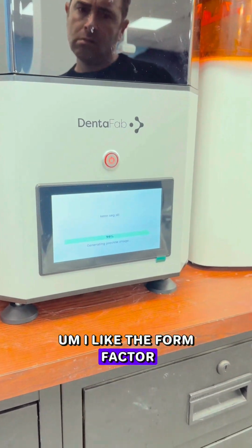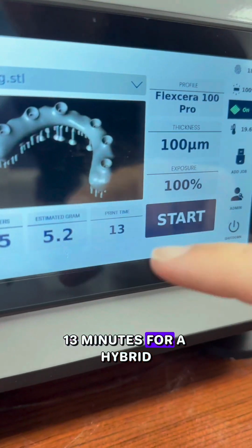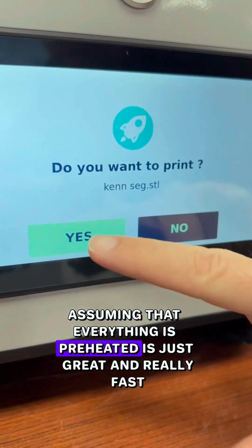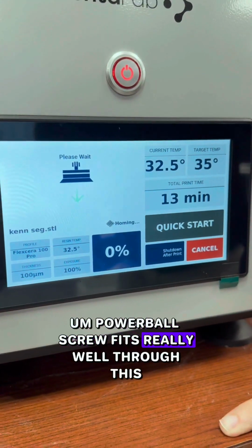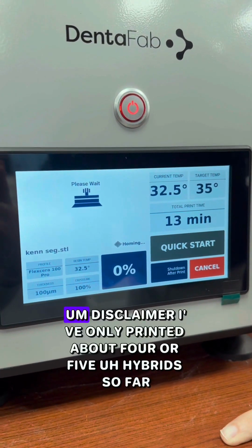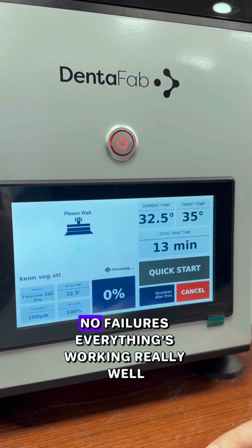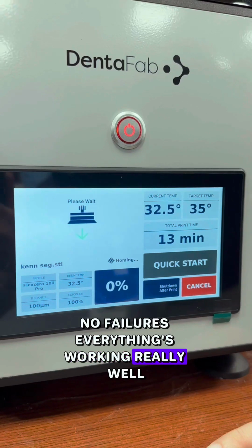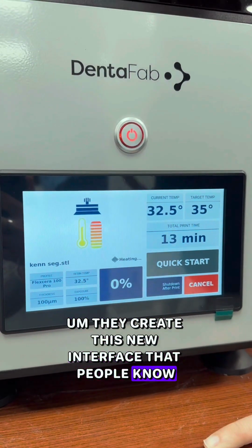I like the form factor. It's pretty small. And again, 13 minutes for a hybrid, assuming that everything is preheated, is just great and really fast. Powerball screw fits really well through this. Disclaimer, I've only printed about 4 or 5 hybrids so far, no failures. Everything's working really well. They created this new interface so that people know it's actually being heated.